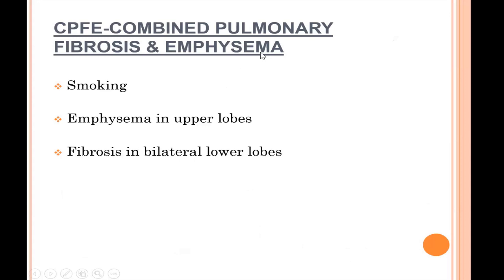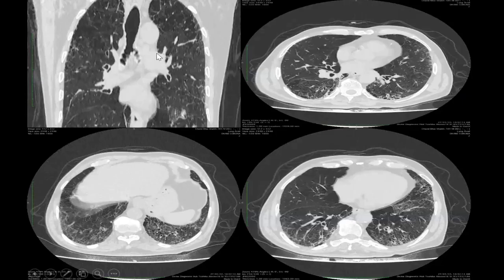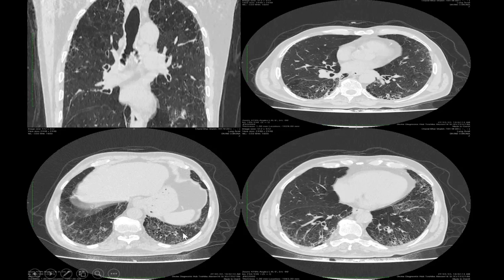The next fibrosing condition is combined pulmonary fibrosis with emphysema. As the name suggests, it shows fibrosis in the lower lobes and emphysema associated with smoking in the upper lobes — it is an exclusively smoking-associated condition. On imaging, there is significant emphysema in the upper lobes and developing fibrosis in the lower lobes, with traction bronchiectatic changes and areas of honeycombing.